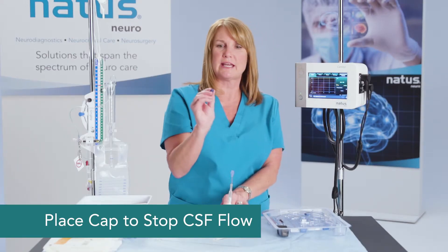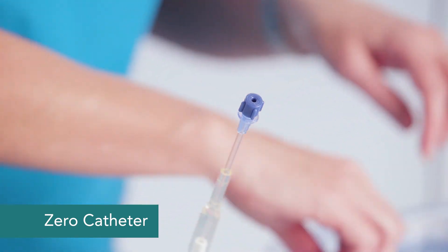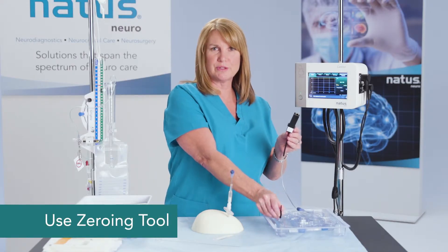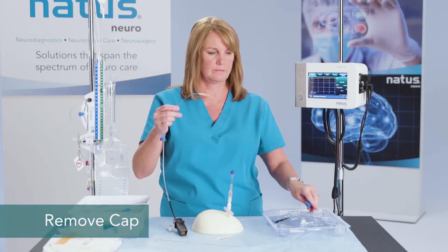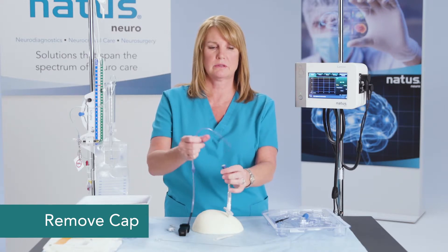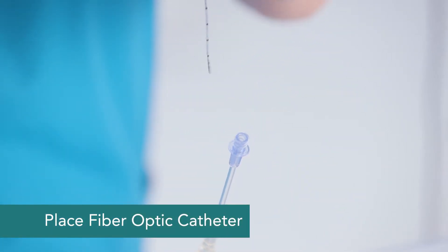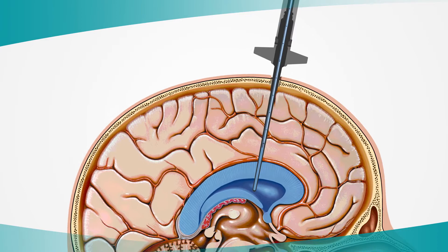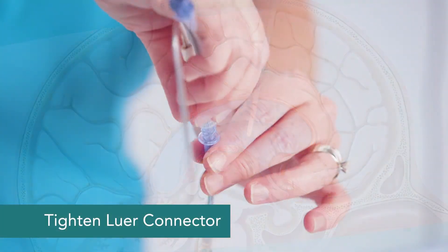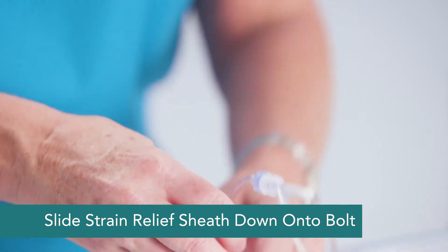I'm going to place a cap to stop the flow of CSF while I zero the fiber optic catheter using the zeroing tool. Once the fiber optic catheter is zeroed, I can place the fiber optic catheter into position. Then I'll slide the strain relief sheath down for additional security.